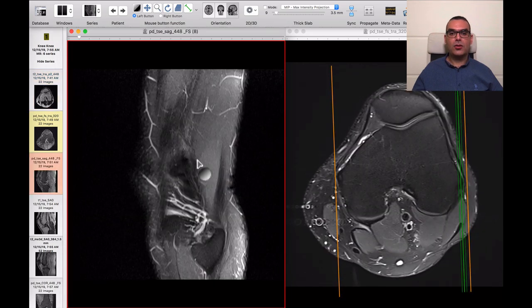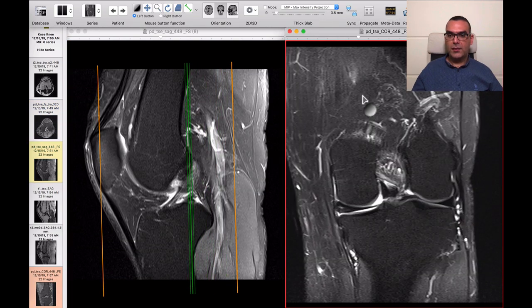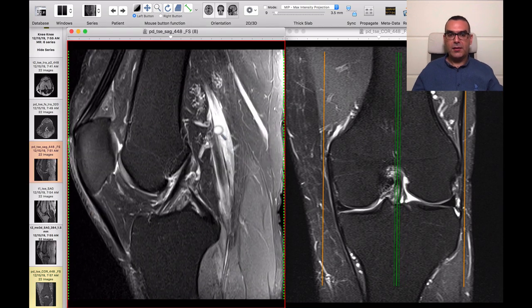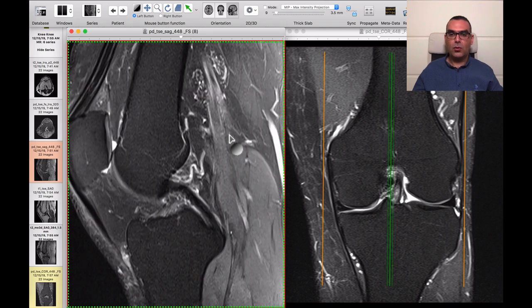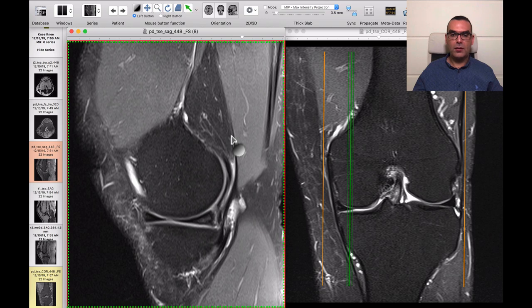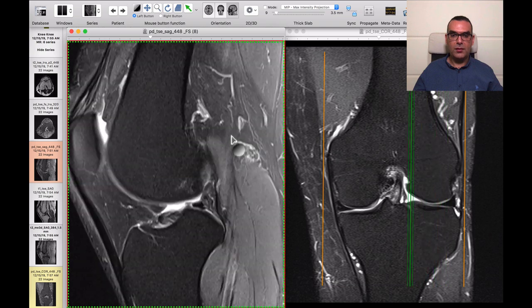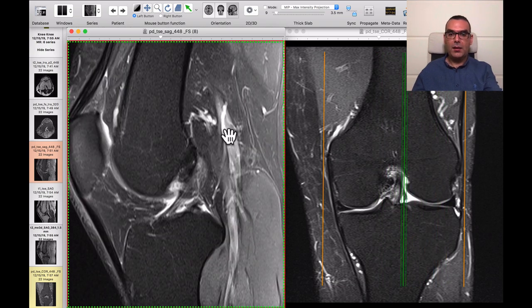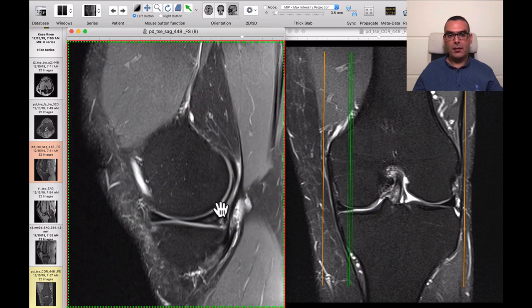Now let's switch to the sagittal and coronal scans. We can see the coronal localizer to orient ourselves — this is the medial femoral condyle, so that's the medial aspect of the joint and that's the lateral aspect. Starting from the medial aspect, we can see there is abnormal hyperintense signal within the posterior horn of the medial meniscus.